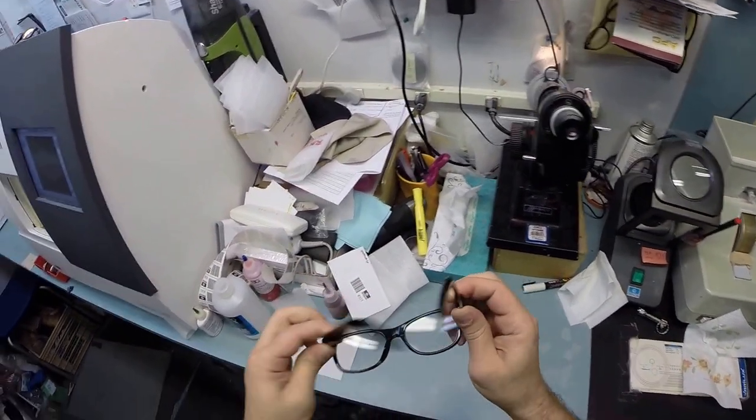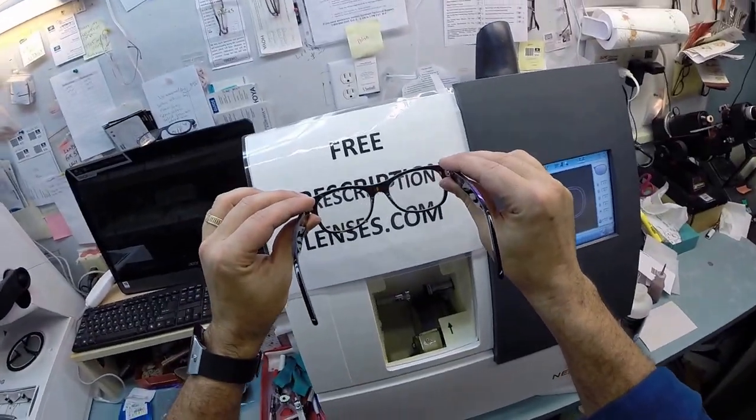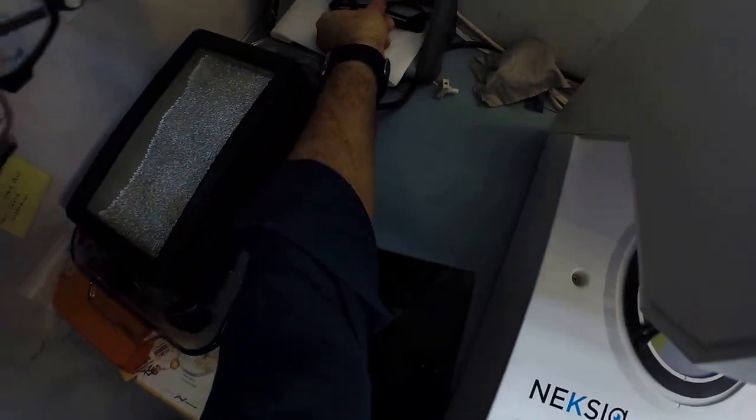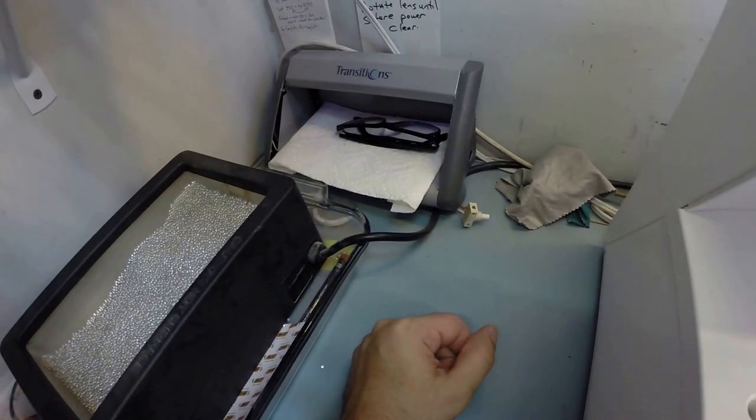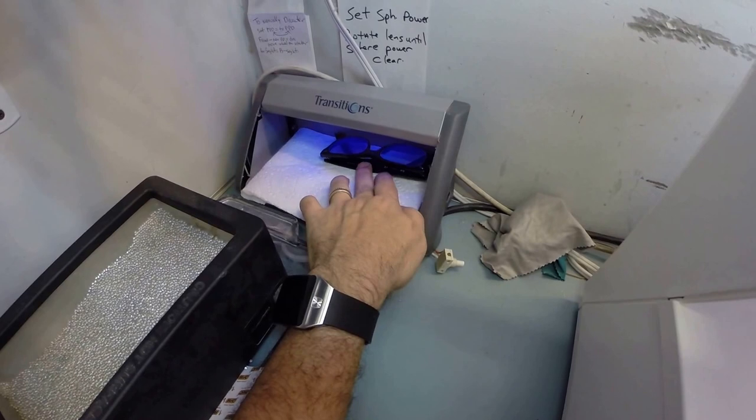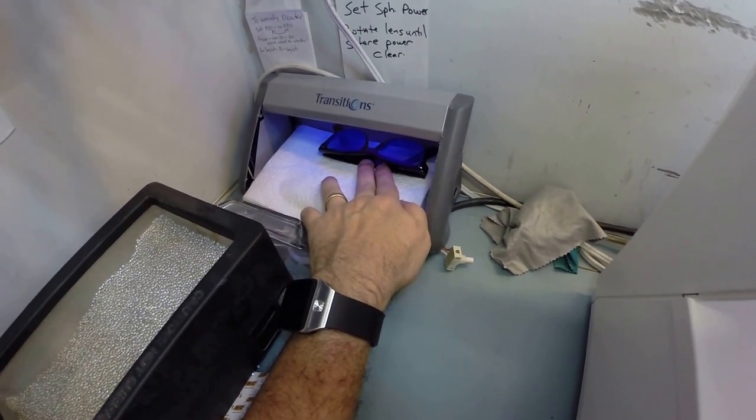This is what your lenses look like while they are clear. I'm going to go ahead and activate the transitions portion of your lens. I'm going to expose them to a strong burst of ultraviolet light. As you can see, it takes about 30 to 45 seconds for transition lenses to darken. It takes a little bit longer when you come back inside, about 45 seconds to a minute to a minute 15.